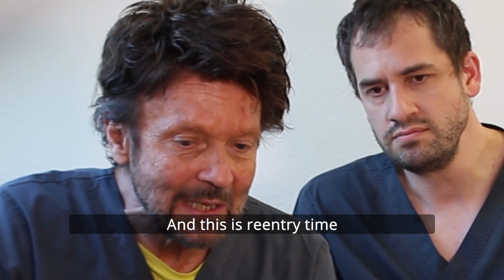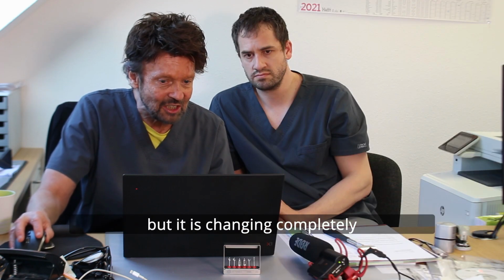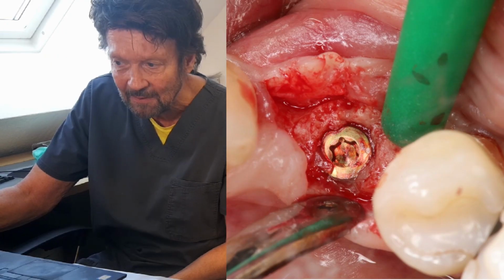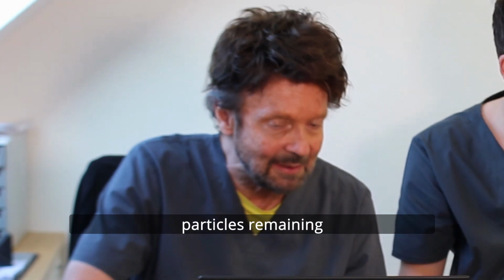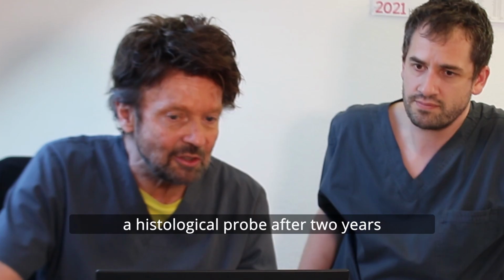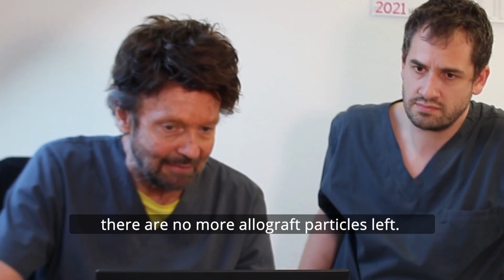And this is the re-entry time, and you see the silhouette of the ring is already visible, but it's changing completely. There are bleeding points, and you see this is living bone, and this ring is reorganized, revascularized in normal bone. Of course, there are some allograft particles remaining, but we found out that if we make a histological probe after 2 years, you will find only own bone. There are no more allograft particles left.